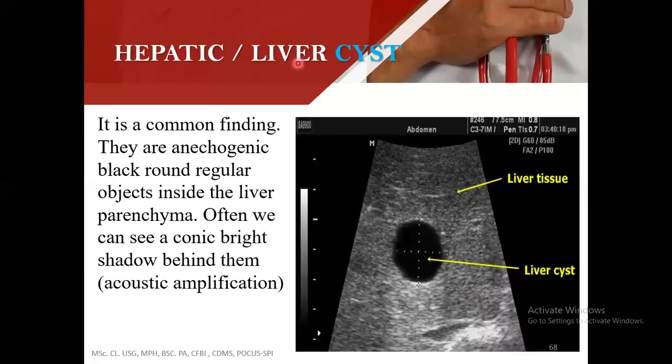Okay, so we take it up to what limit, what measurement? That we know that above this measurement, in everybody, the liver is enlarged. It says 14 to 15.5. Exactly. So that's the limit. The limit is 15.5.